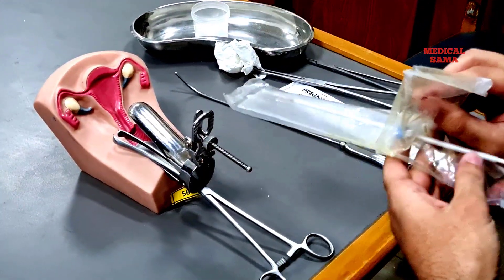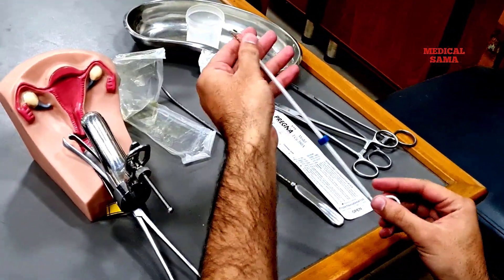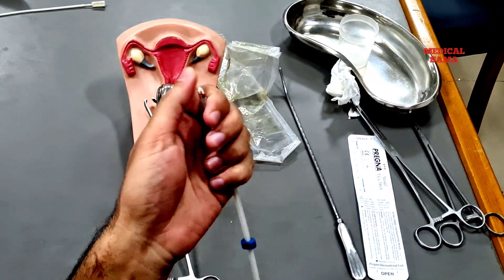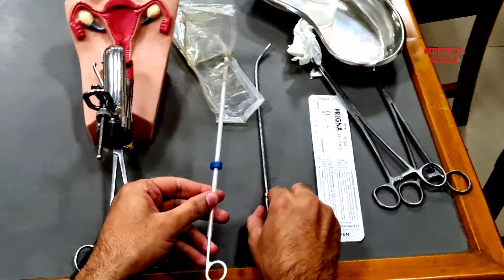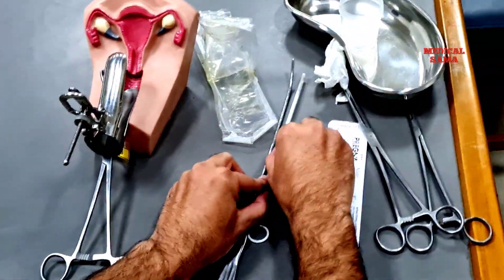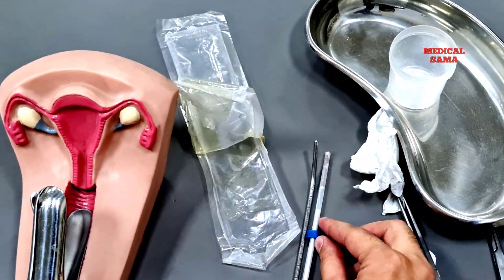Now first we open the IUCD, remove the IUCD, and with the help of sterile gloves, load your IUCD. You should place the blue flange on the sheath at the proper length as measured with the sound — in this case, 7 centimeters.